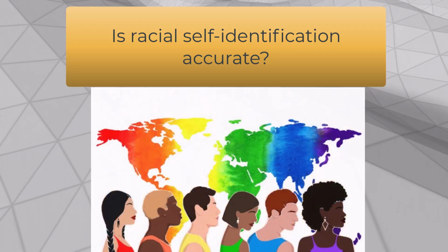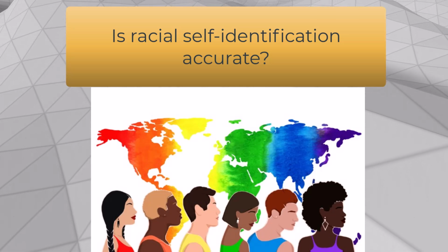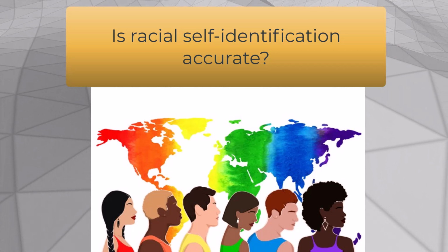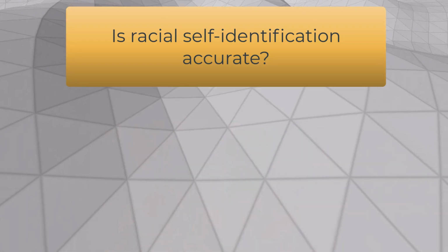A subject may identify as Black. However, they may have one parent who is Black and the other parent is Caucasian. Classifying this subject as either Black or Caucasian would produce predicted results that are not necessarily correct in either case. Race-neutral reference values would be more appropriate in this case.